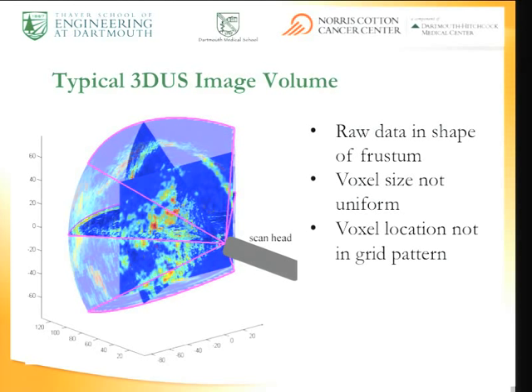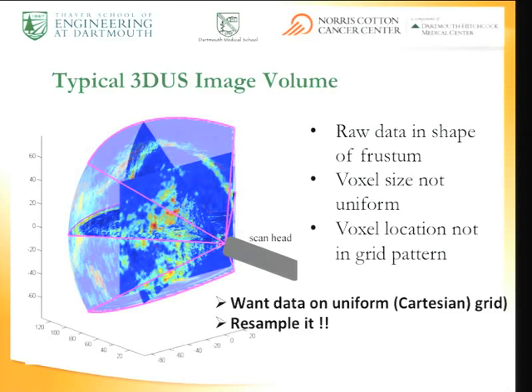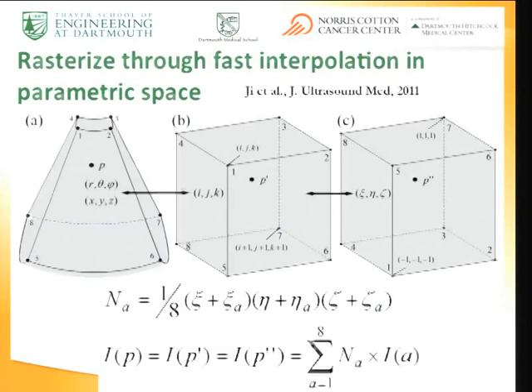And so what we did, and this was an observation that Songbai Jiang came up with, was we resampled this, or rasterized it, as he liked to refer to it. Because he's kind of a finite element jock, he recognized that as long as delta R, the R sampling, is not too big, these 8 points look like a deformed hexahedral element. So you can take advantage of the finite element isoparametric mapping, which allows you to map both the geometry and the field, in this case the image intensity, through basis function expansions.